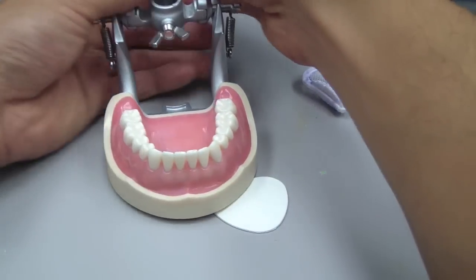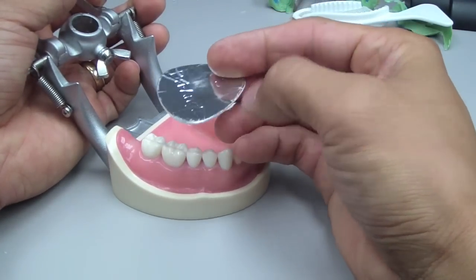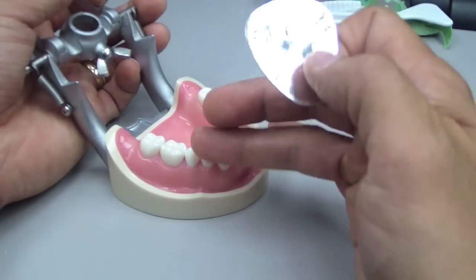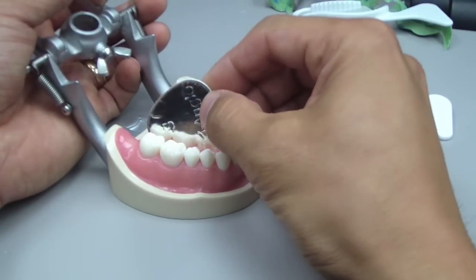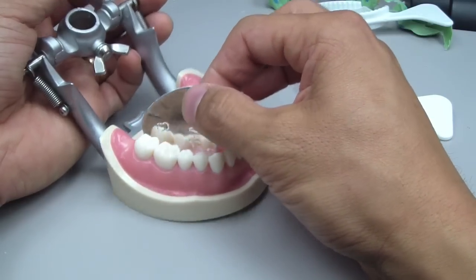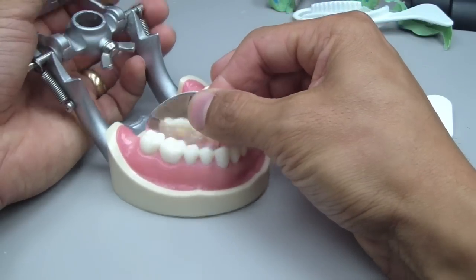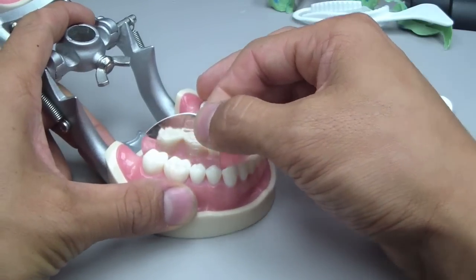Another tip for mandibular impressions: take a dry angle — if you have the type with a silver foil side, place that silver side toward the preparation. Have the patient elevate their tongue to the roof of their mouth — normally they're anesthetized by a mandibular block. Then place the dry angle as deep as possible between the tongue and the lingual mucosa. Have the patient rest their tongue, and as it slowly depresses, it takes the dry angle with it, effectively retracting the tongue as well. That was a nifty tip.